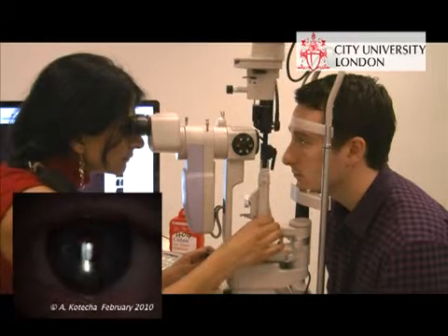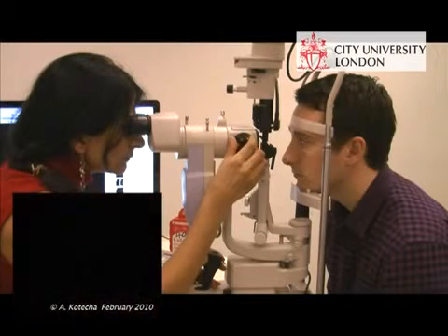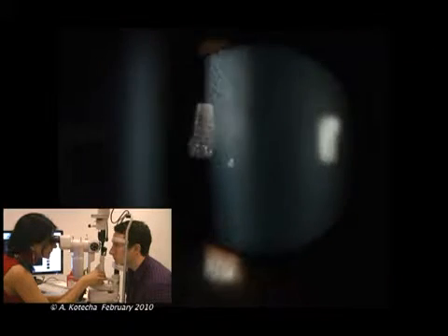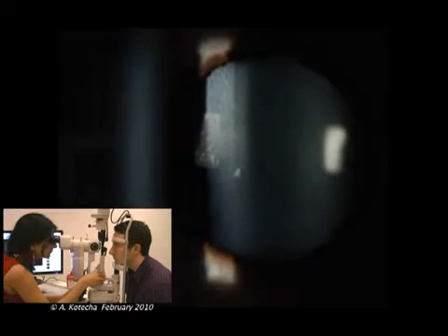Start with low to moderate magnification and focus the light on the iris surface so that you're in the right plane of focus before moving into the pupillary area. You can see just to the left of your screen that mottled appearance, that orange peel texture, which represents Purkinje 3 or the anterior capsule.